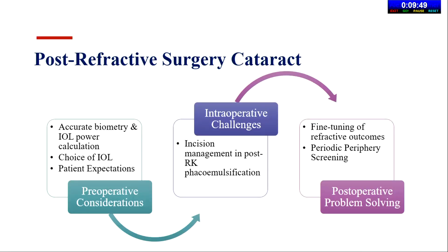Thank you, sir. A very good morning to all of you. I'll be tackling the post-refractive surgery cataract, no financial disclosures. The challenges that lie with us are preoperatively accurate biometry and IOL power calculation, the choice of IOL, and addressing patient expectations. Intraoperatively, incision management in post-RK phacoemulsification; post-LASIK and PRK are relatively simple to manage. Phakic again poses intraop challenges regarding explant of the phakic. Postoperatively, fine-tuning of refractive outcomes and periodic periphery screening.